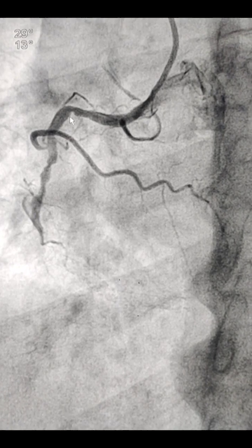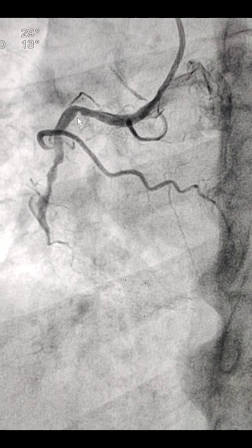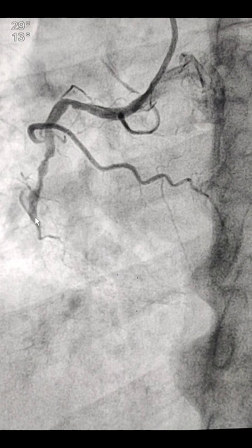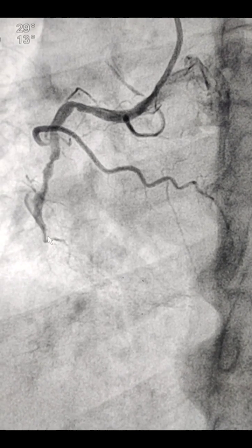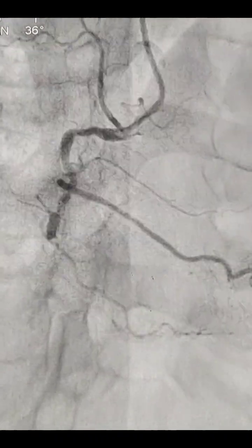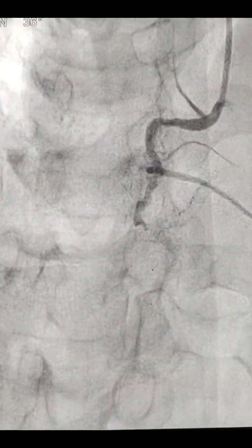And here what we are seeing is the catheter is up to here, so this is a probable vasospasm. So there is no lesion probably in the proximal, but it is a thrombotic lesion right from the mid RCA, and before the stent there is a 100% thrombotic occlusion. And this is again the cranial view, and you can see the same view. Probably the stent is in the distal RCA, right from the RCA to PLV. Probably after opening only will come to know.